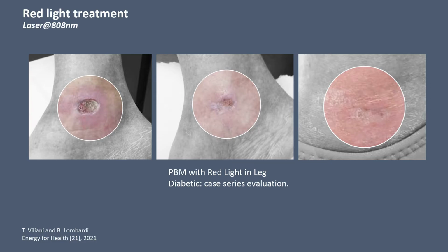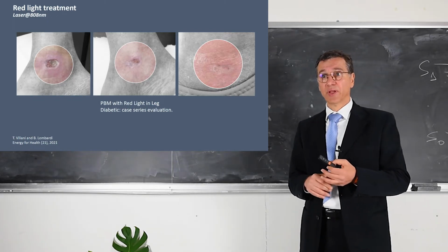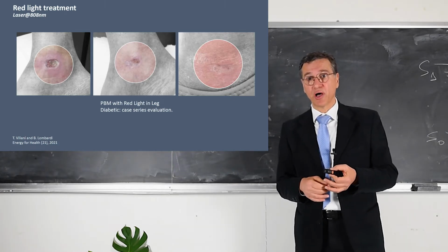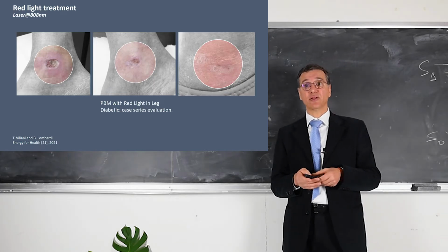Moving to the near infrared, these authors are working on diabetic leg, and they also observe a healing process after a few weeks by using 808 nanometers.